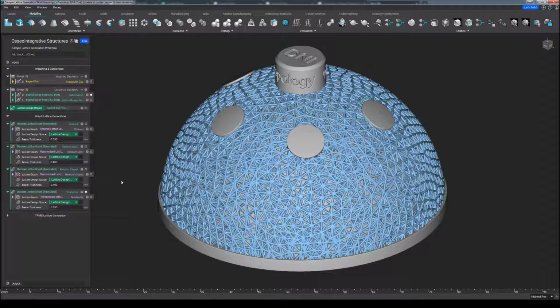If you have used nTopology a little bit before, you're probably very familiar with these lattice structures already. At its core, these lattices are not very hard to create using native blocks. However, these custom blocks offer the user a very quick and easy way to drop in their desired fill volume and generate the structures with all the bells and whistles already in place.